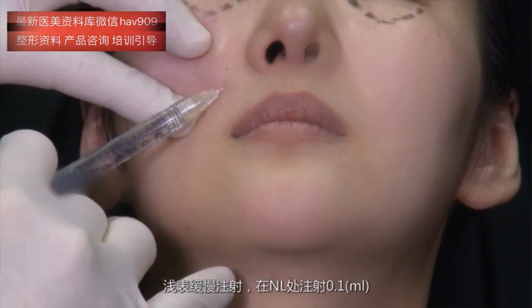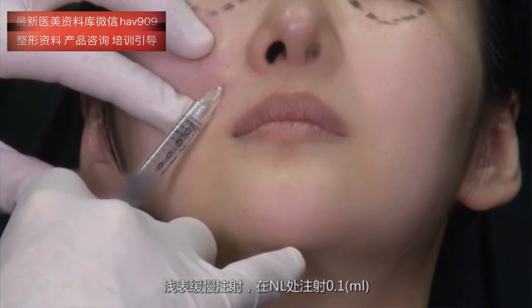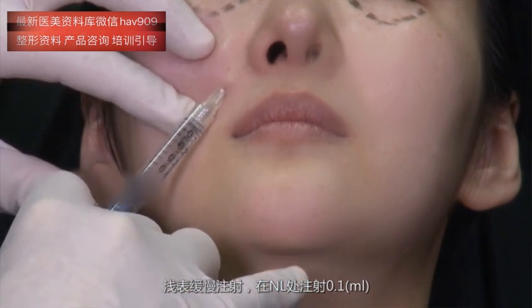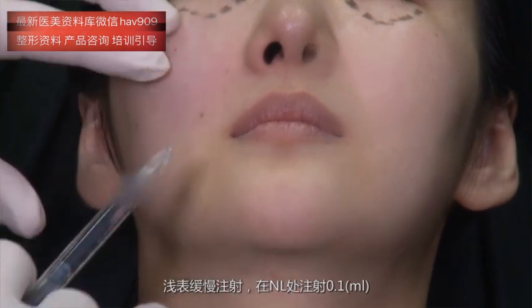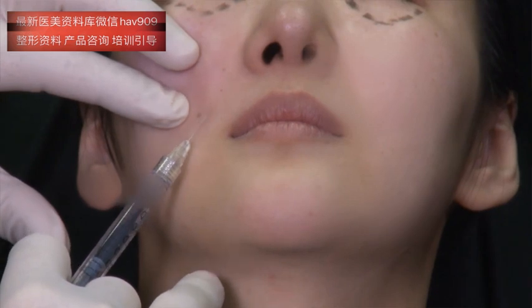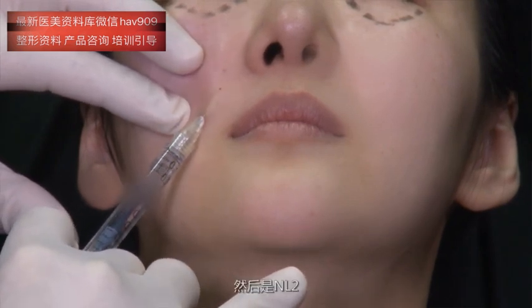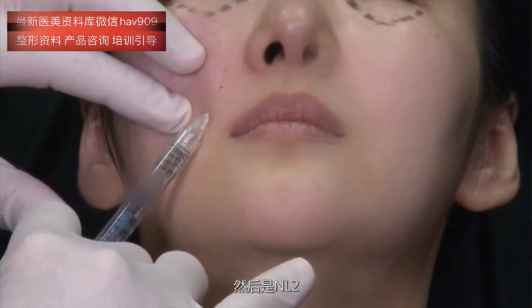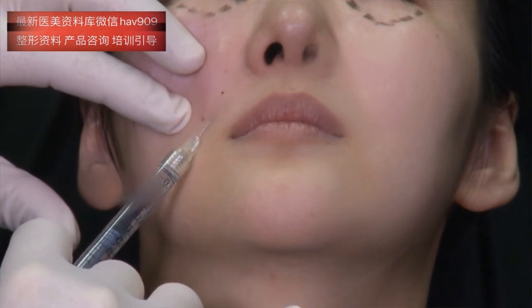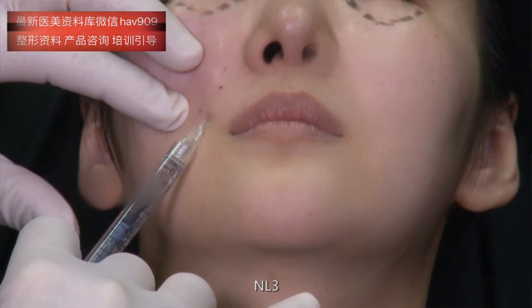And we very slowly inject 0.1 in NL1. And NL2, and NL3.